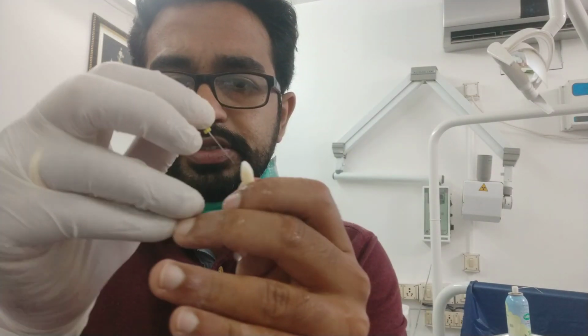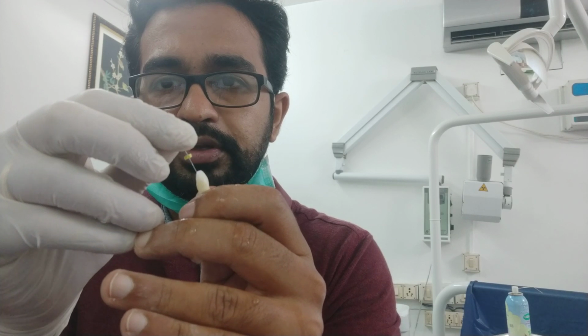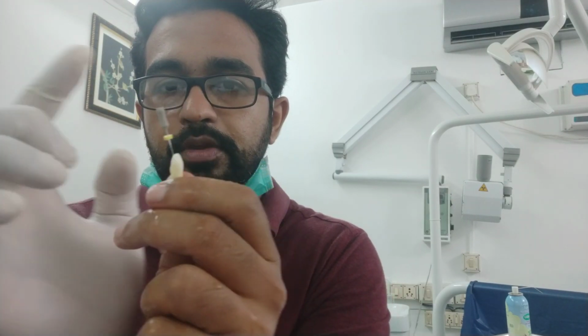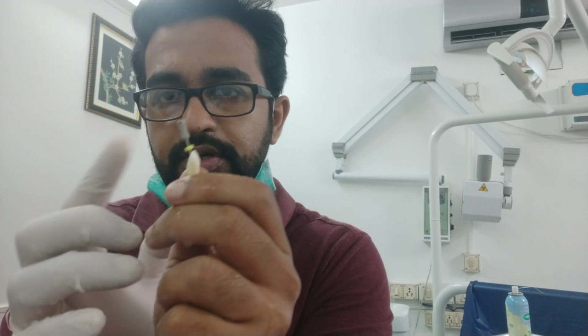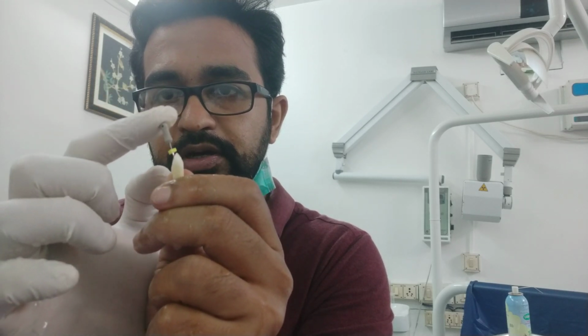So as you have seen already, I have made the access opening. Now you can see here I am again putting the file inside in a watch winding motion, and it's going very easily now. You see the angulation has changed a little bit. Earlier it was like this, but now it has become like this. So it should be almost straight. The access opening should be in a straight line access, right?